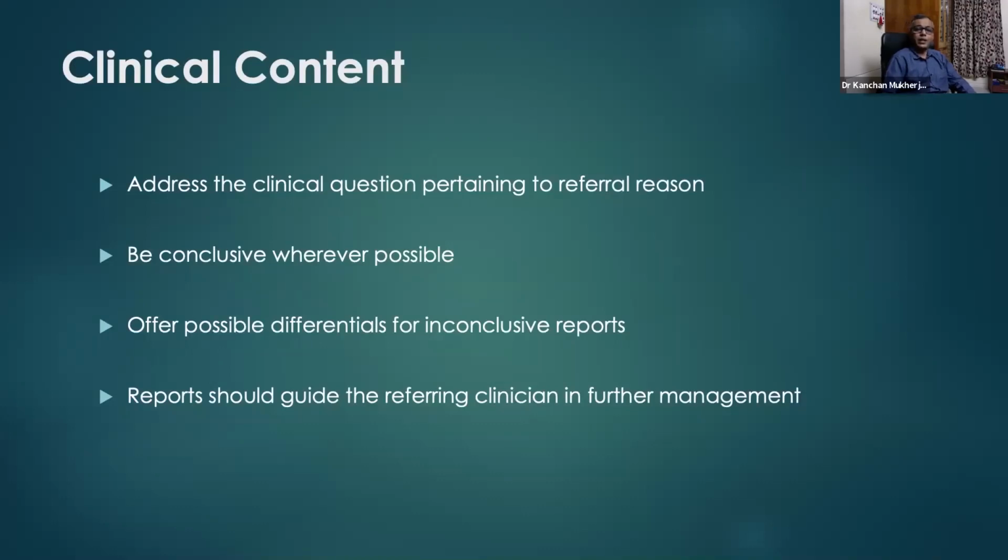When you are dealing with clinical content, you address the clinical questions pertaining to the referral reason and be conclusive wherever possible. And if it is not possible to draw a conclusion, you offer possible differentials. Okay, and put yourself in the shoes of a clinician so that your reports guide the referring clinician in further management.